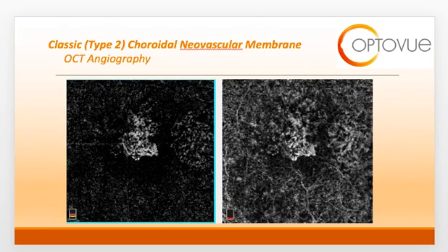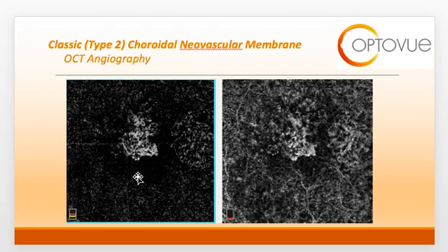Just as OCT angiography is useful for type 1, it is also extremely useful to identify membranes in type 2. The hyper-visible area or net is going to originate in the choriocapillaris slab. However, with a type 2, remember that it is going to go above the level of the RPE, so the outer retinal or avascular slab is going to be affected as well. This is a nice way to differentiate between the two membranes and solidify a diagnosis when you're not sure.